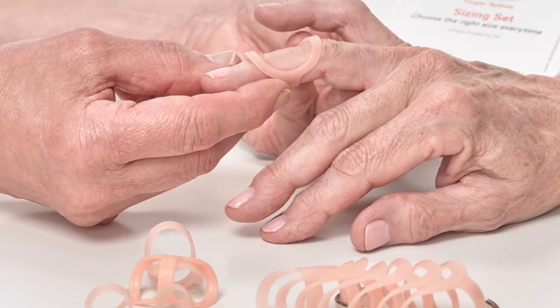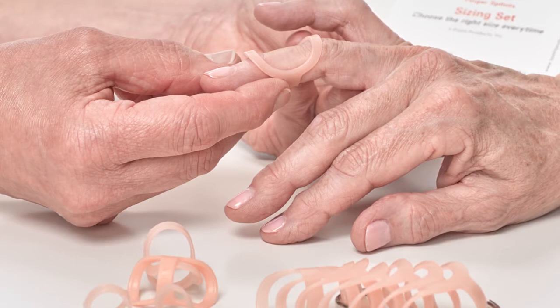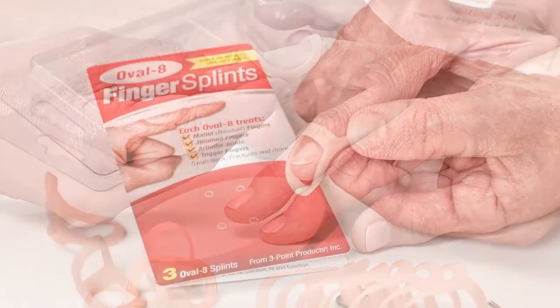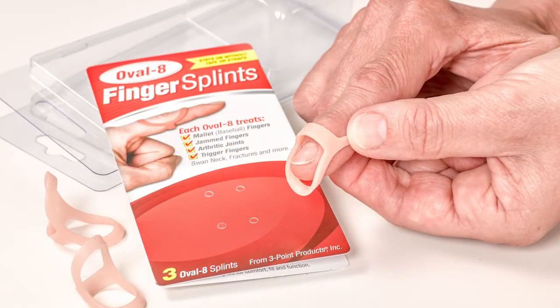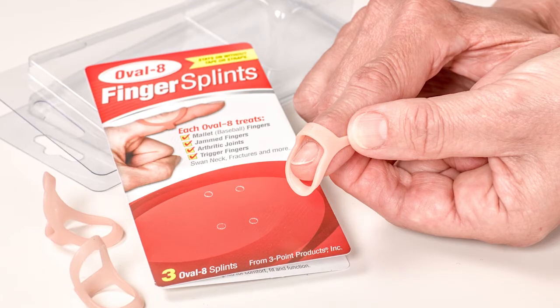The best way to choose the correct size is with the splints themselves. The Oval-8 sizing set includes one of each of the 14 sizes so you have everything you need for the best fit. The next best option is to choose a graduated set that includes three consecutive sizes so you have additional sizes to wear if changes in swelling or temperature affect the fit.